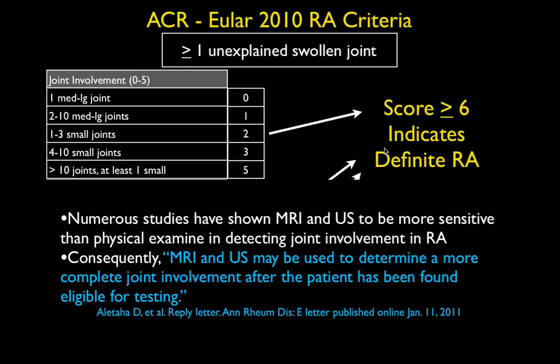That's actually been looked at, and generally what's found is that you lose very little information if you image the hand and the wrist on the dominant side of the individual. Now, typically people will image the symptomatic joints, but if they're symmetric, a generalized joint involvement, or if you're just trying to do a joint count without clinical findings to suggest a specific area, then it's recommended to do the hand and wrist of the dominant side. That's a study by Østergaard and colleagues from Denmark.